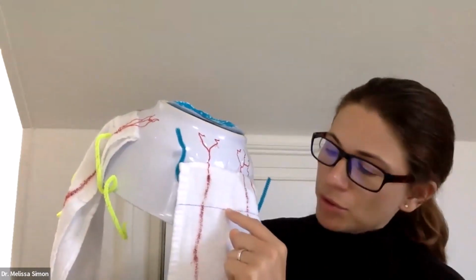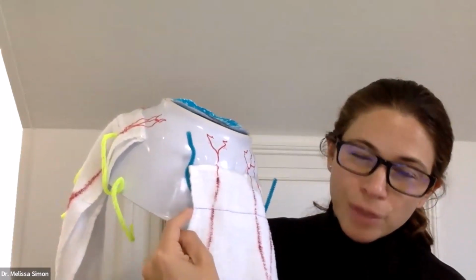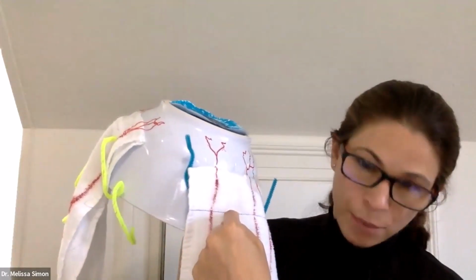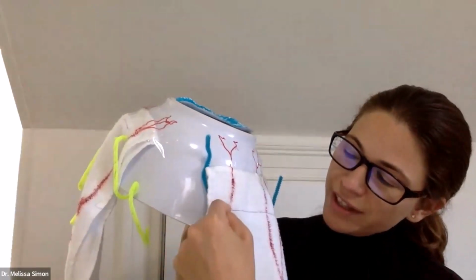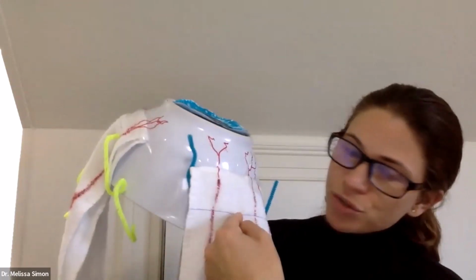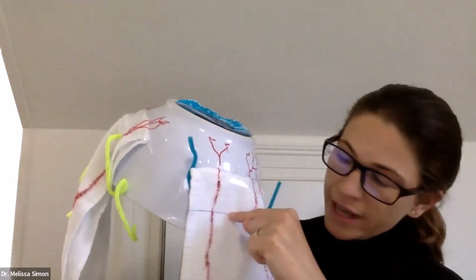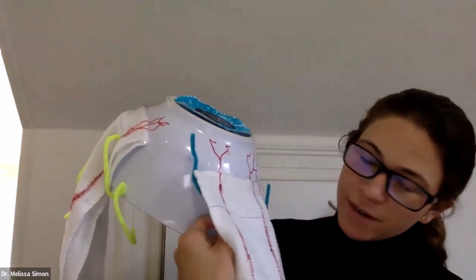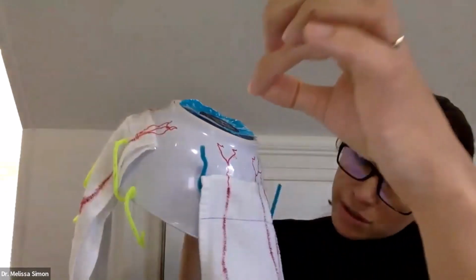You start the same, you go partial thickness through the muscles, center to edge, but then you double back and you go edge to center through the same holes. And it's partial thickness, but it's more superficial. You're going really like just skimming the superficial layer underneath the ciliary arteries. And you're doing that to set yourself up to do a full thickness through that original hole again. So then you turn your needle around, you go through the original hole, and your needle comes out underneath the muscle full thickness. You'll have a loop here that you'll pull it through to lock it.